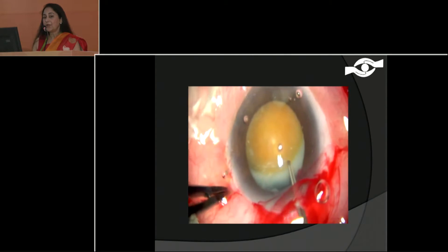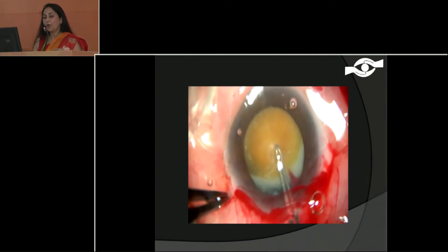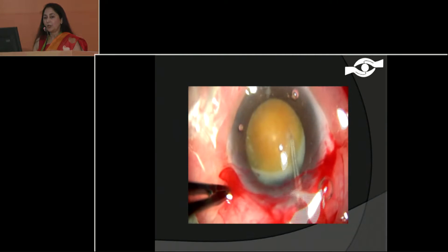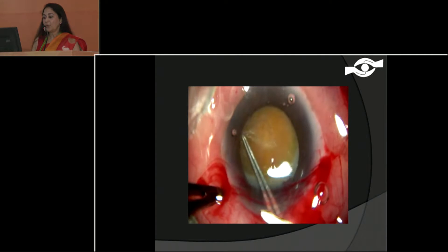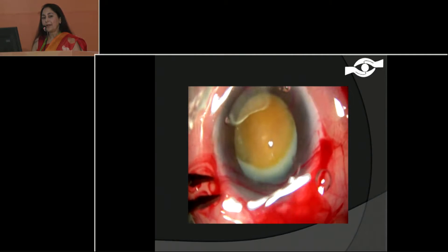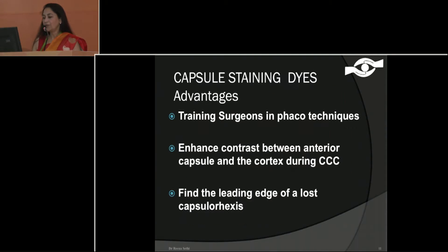In these cases, whenever there is a lot of anterior capsule fibrosis, one must be very careful to be very gentle because it can go outward. Whenever you try to push it too much to the periphery, it may just run away. An important pearl: you need to have the patient's eye parallel — the iris plane should be parallel. Head positioning is very important because whenever the head is tilting to the right, you will see the capsule runs away to the right.